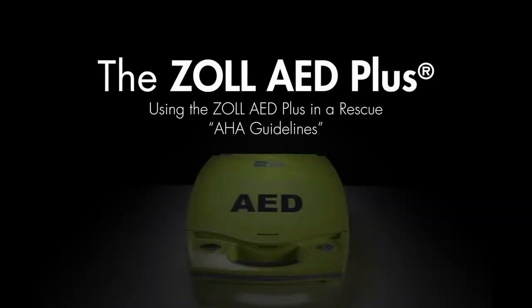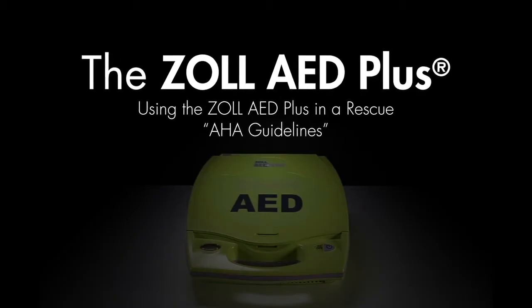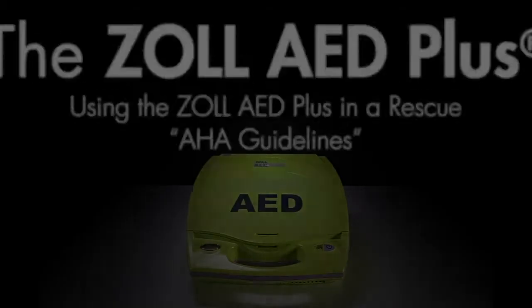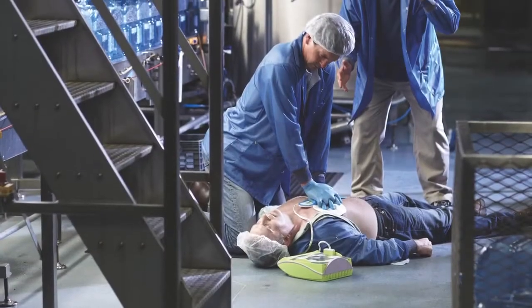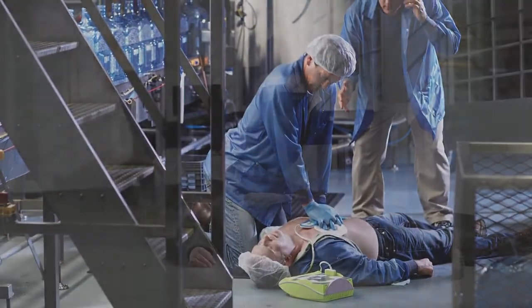Using the Zoll AED Plus in a Rescue. Cardiac arrest is a leading cause of death worldwide, and it can happen to anyone, anywhere, at any age.